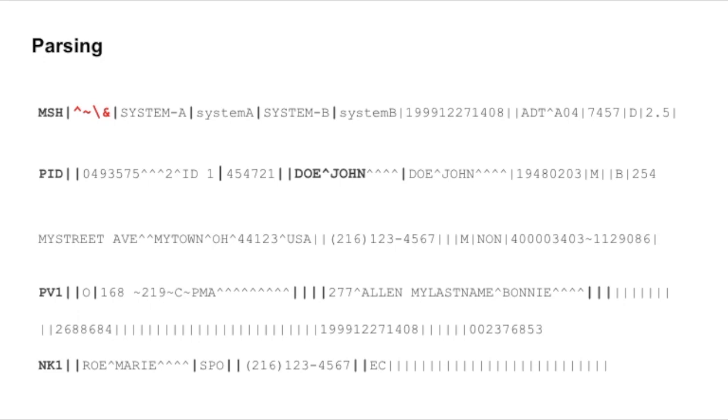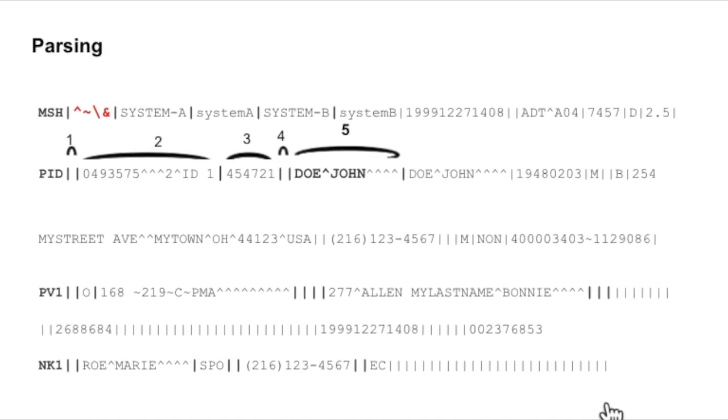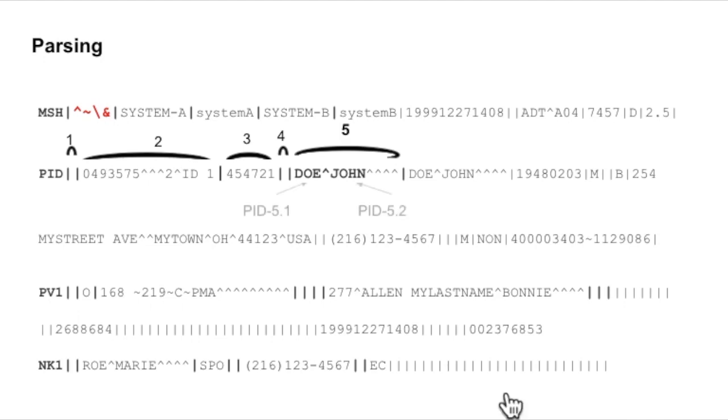If we count the number of fields till the part which is the name of the patient, we can retrieve the last name from the fifth field, first subfield, and the first name from the fifth field, second subfield. Then the parsing in this case will be PID5.1 for the last name and PID5.2 for the first name.